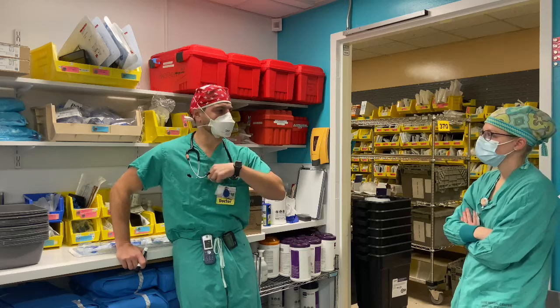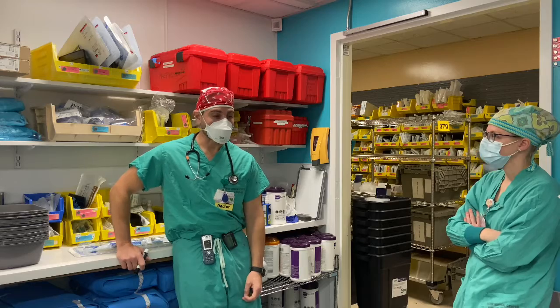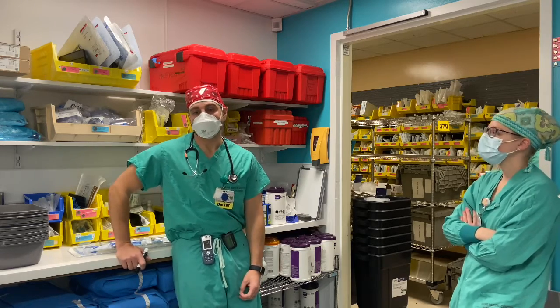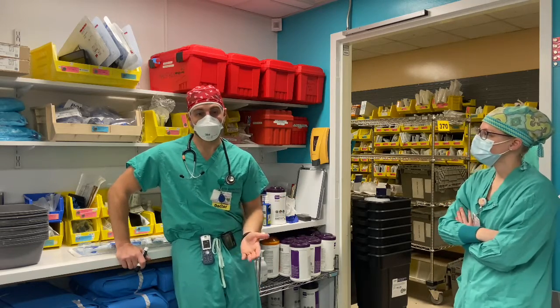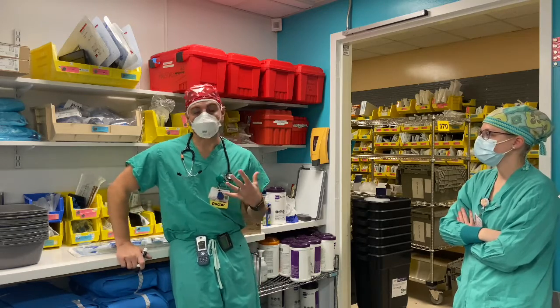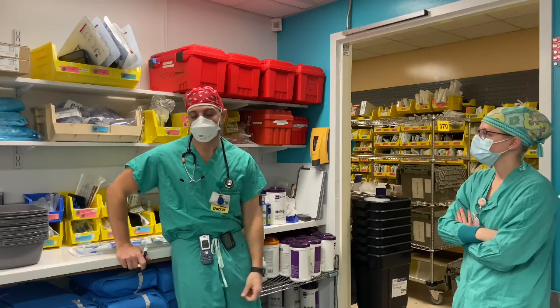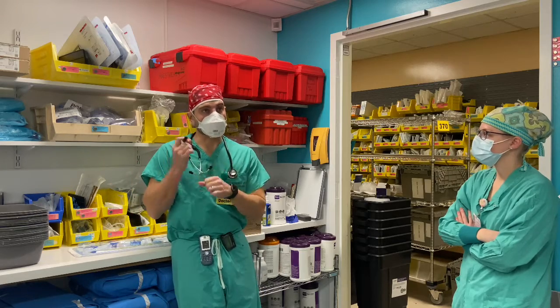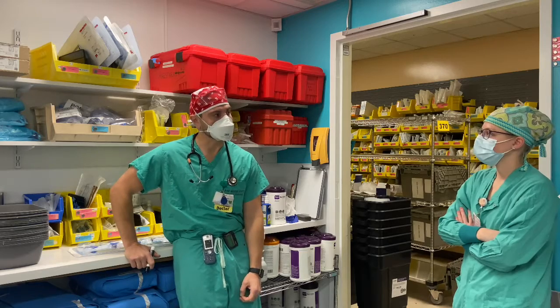They're just kind of cleaning up things on the surface. And the reason we use larger endotracheal tubes in cardiac is because the patients are likely going to be intubated for a longer period of time. If they have any issues getting off the ventilator in the ICU and they need to be bronched, where somebody takes the camera down and washes them out and does a real therapeutic bronchoscopy, as opposed to just a diagnostic one where you're looking with the tiny camera, a good therapeutic bronch needs a bigger lumen tube to accommodate the bigger scope. So we tend to use bigger tubes anytime we think somebody might stay intubated longer.